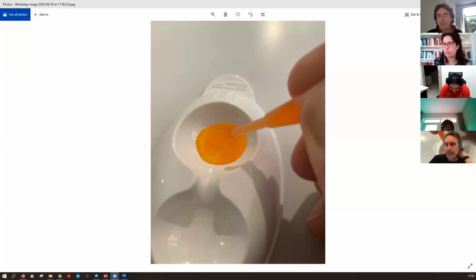Sure. It was really partially based on Renier's advice, partially on Kyriakos. Kyriakos had really said how important it is to get the wetting right, and he preloads his patients through 2 or 3 days of consistent dropping before they come in. I think that's part and parcel of this, which wasn't really said in the video. But we were striving to get consistency, and realized that to drop fluorescein off what used to be called florets, whatever stick system of fluorescein these days is wetted, you would get an inconsistency with the volume of the actual fluorescein within the drop.